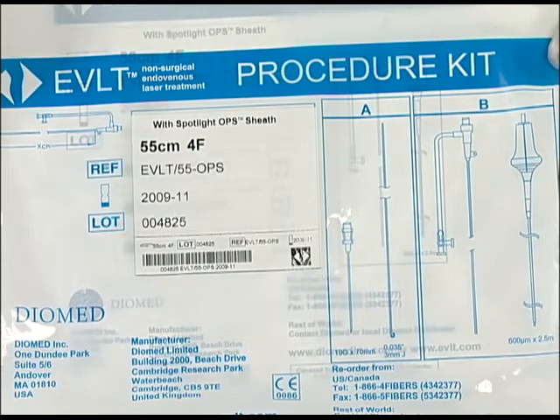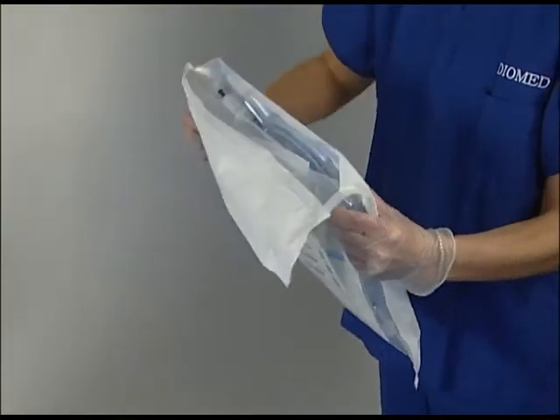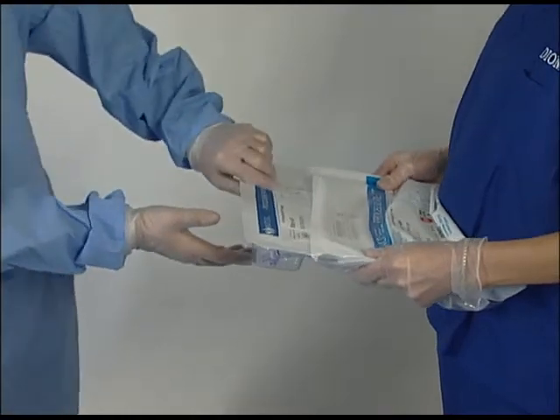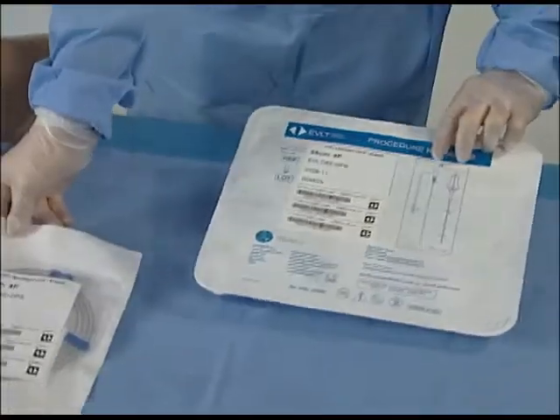Once patient has been prepped, draped and positioned properly, identify the appropriate length procedure kit and open. Available barcode stickers may be used for documentation purposes.